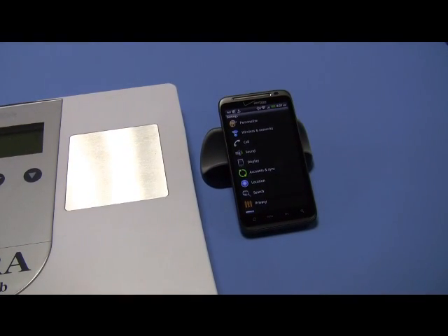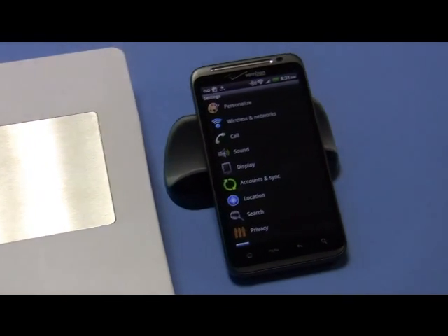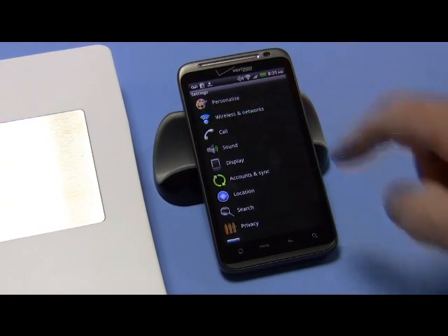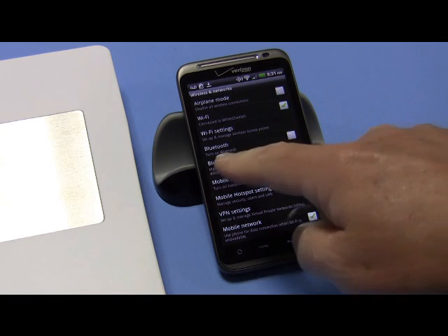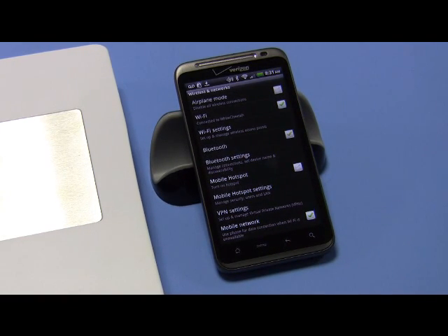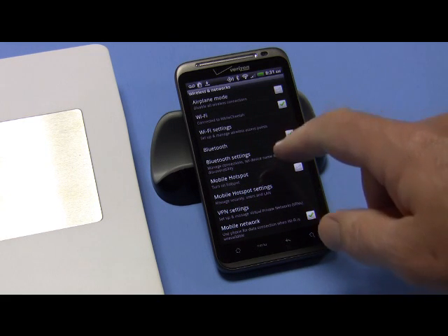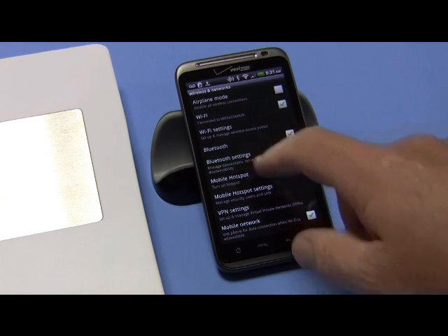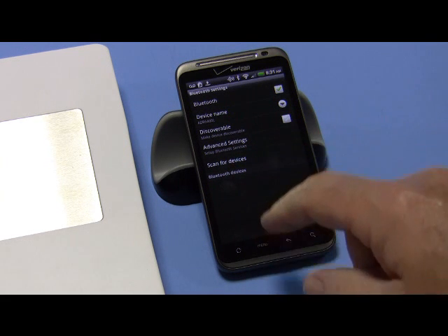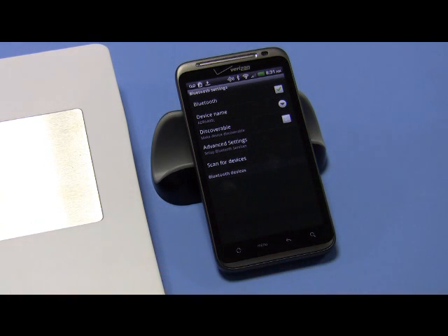So then you go to Wireless and Networks, and under Bluetooth right here, turn Bluetooth on if it's not on. Okay, Bluetooth is on. Then go to Bluetooth Settings and you'll see there's nothing under Bluetooth devices, so what we'll do is first activate the scale and get it into Bluetooth mode.